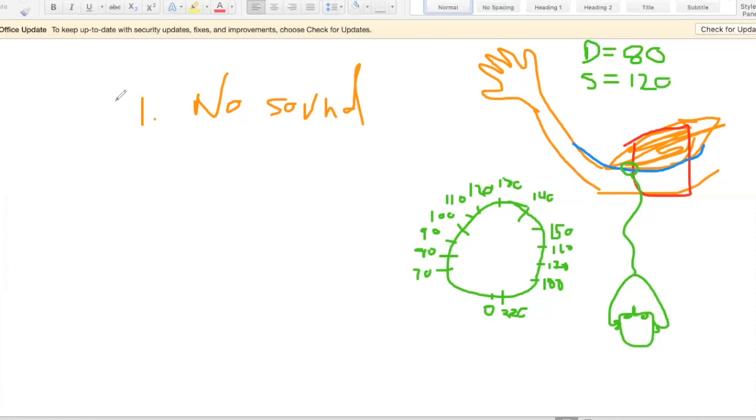So at first, there's no air in the cuff, none. I put the cuff on, but the cuff is loose and I'm listening. What am I gonna hear out of my ears? There's no air in the cuff. I did place the cuff around the brachial artery and put the stethoscope here, so everything is set up the right way. But right now there's zero air, so there's zero pressure in the cuff. So I'm not going to hear any sound. And I'll explain what that means.